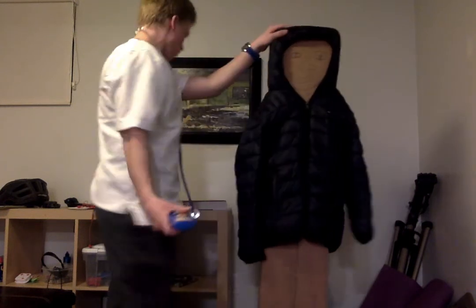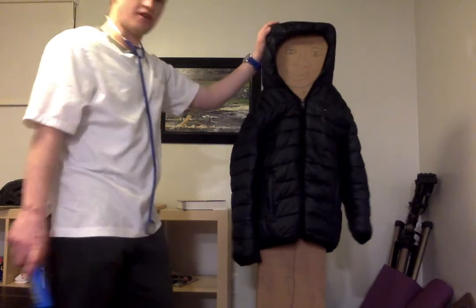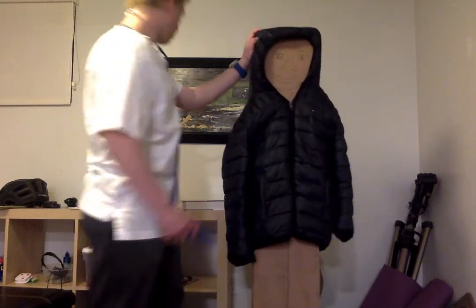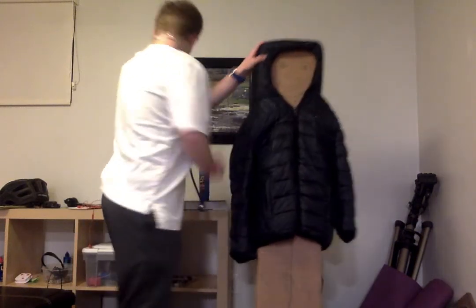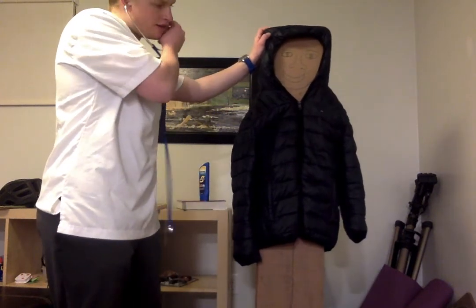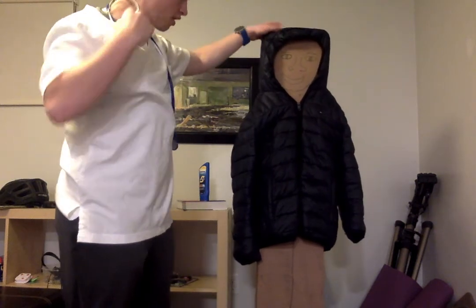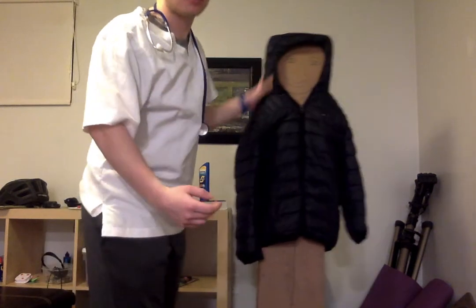I got a forehead one. Check the oxygen, 97. Great, especially at this altitude. So everything's looking good there. Everything was normal. Take this off. And now I'm going to go down into the feet.